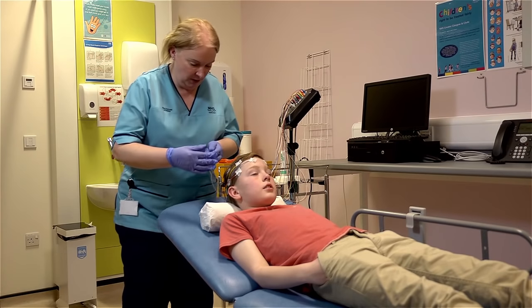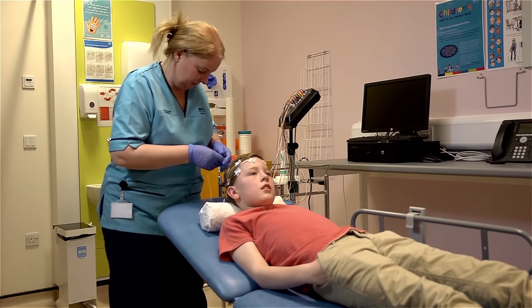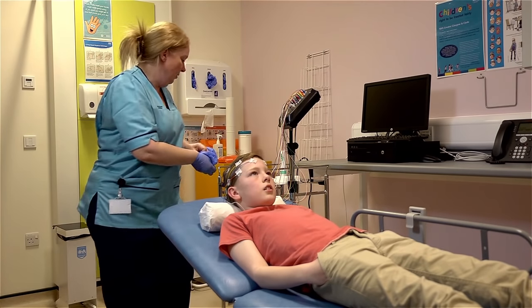Just popping the two on your shoulders. These are little stickies. And on this side. Okay, so that's them all on now.